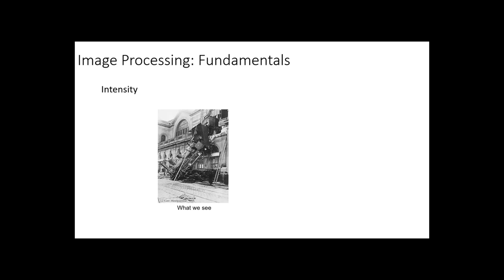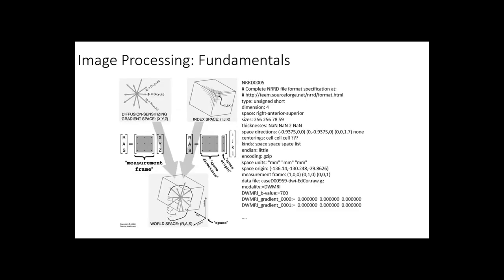When you see the image, go back to the previous slides. The image is like this in this cube, right? We need to separate our background points from our brain points, the points in the brain. That is what I'm interested in, but some are background. If you see the background, what you get is an image like this too. So we need to do segmentation to segment this brain out from the whole image.